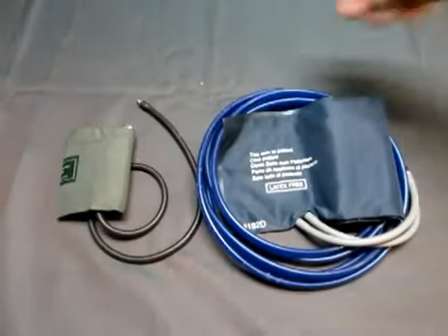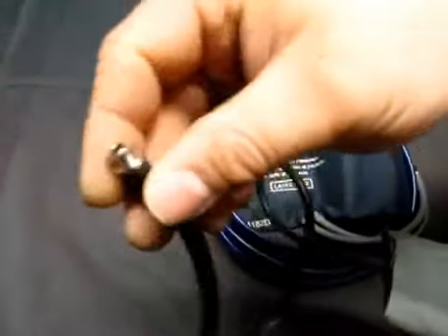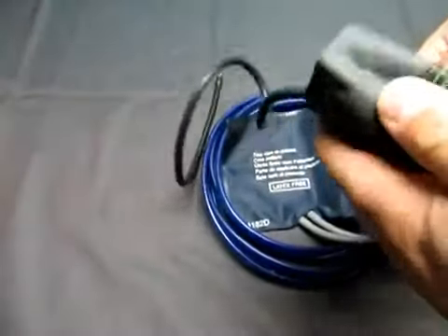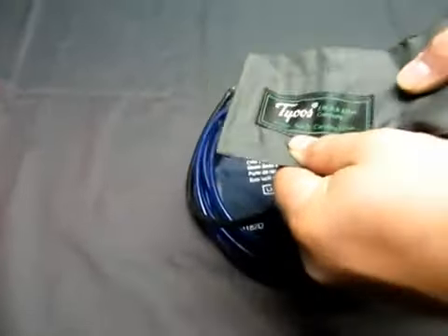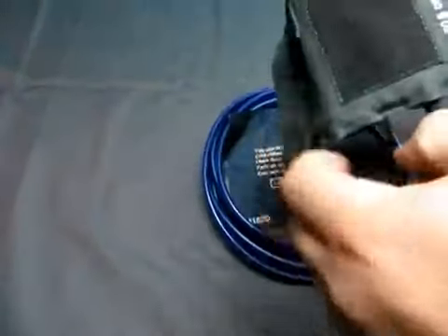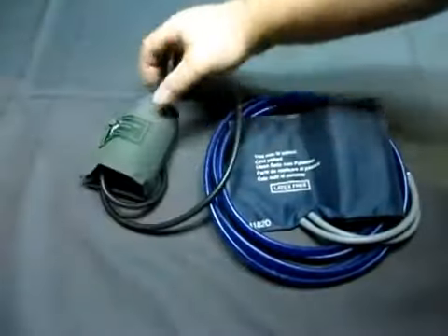Up for auction, we have a lot of two blood pressure cuffs. The first one's got one cable, and it is a Tycos — not that one. It's a child size, 20.8cm max size, with the bladder inside.